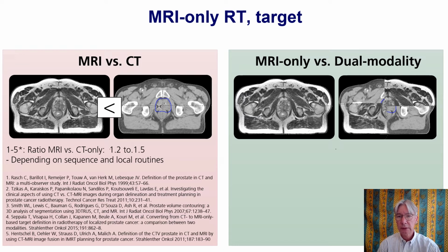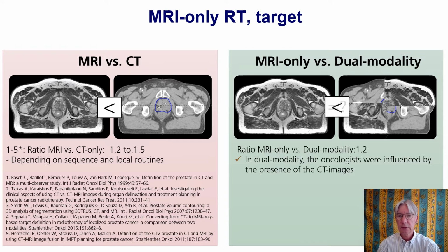So will the volume still be changing? We couldn't find that much information on that, so we did a study of our own, and we found that the volume still was larger using the dual modality workflow compared to MRI only.